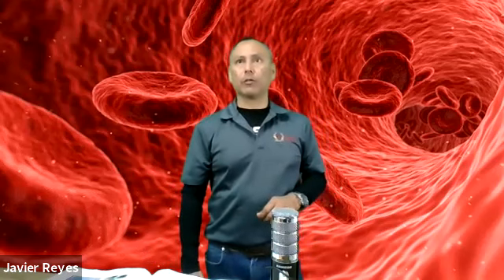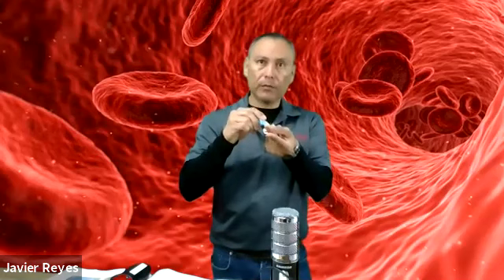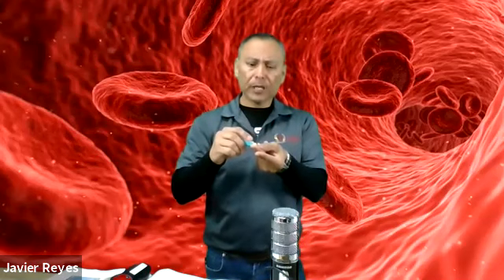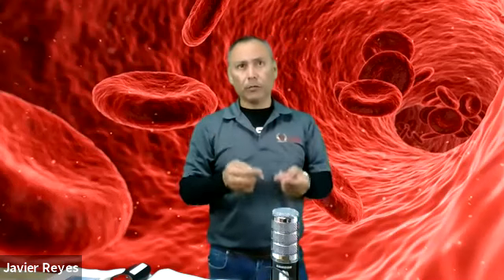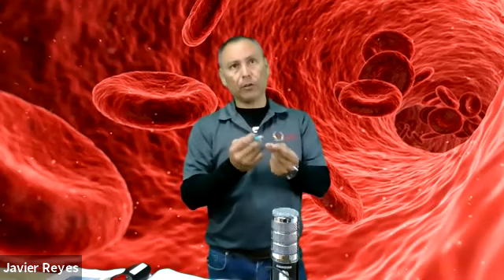Deeper skin punctures are more painful because pain fibers increase in abundance below 2.4 millimeters. So again, how can you cause pain? When you are placing the lancet on somebody's finger and you press the lancet device too deep, too hard on their skin, the needle or blade will go deeper, and that is what causes more pain. As long as you make good contact with the skin, that's all you need.